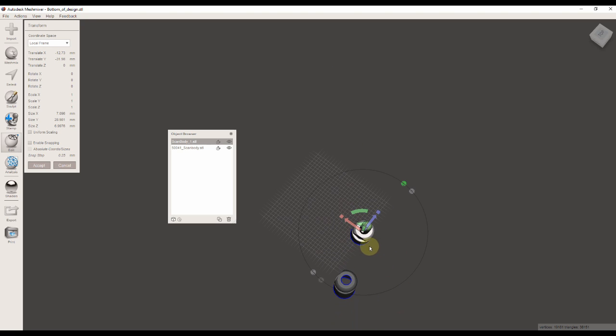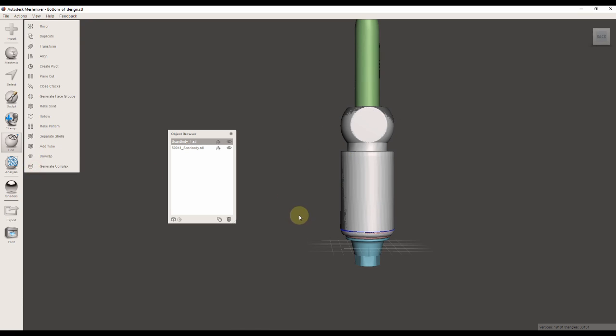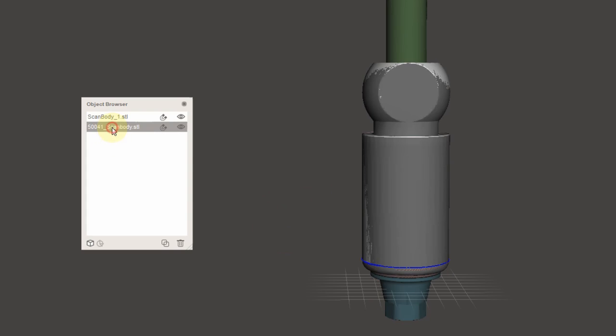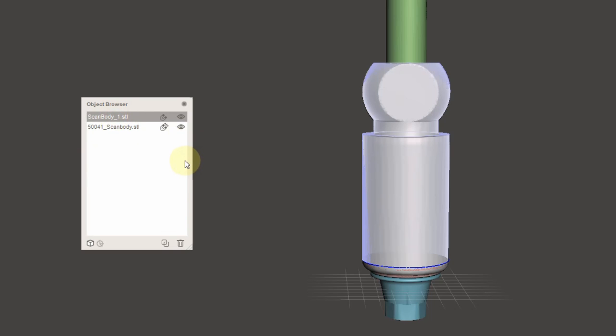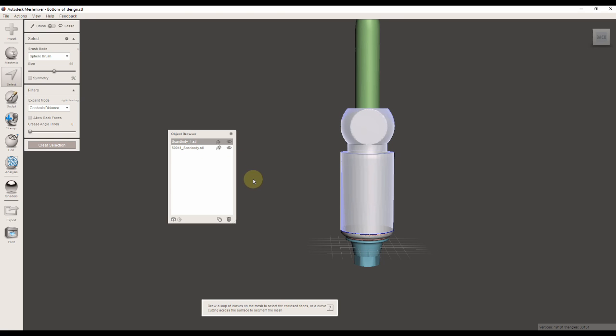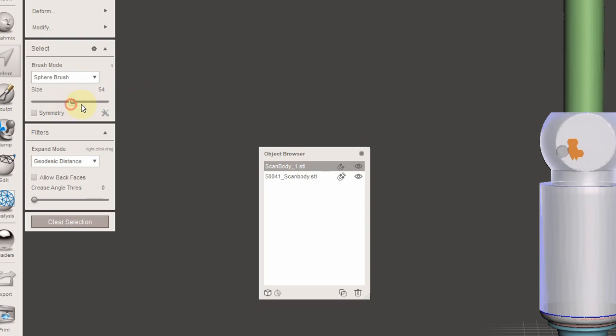I'm going to move it really close to the original DESS scan body scan. It doesn't have to be perfect. Then I'm going to click on the DESS scan body, click on the magnet, click on my scan body scan that I want to align, and then I'm going to take a bigger brush and mark all the similar areas.